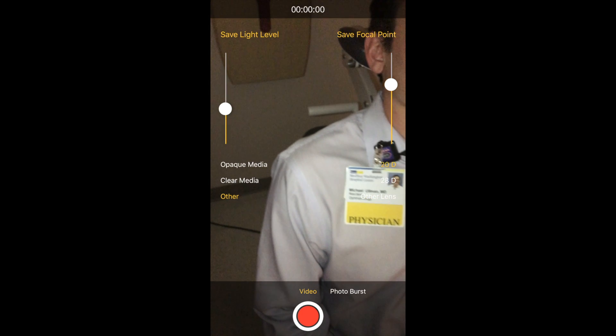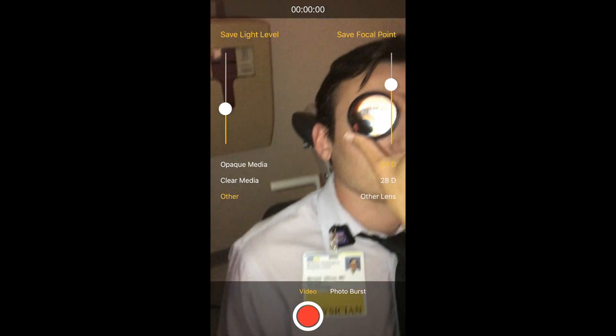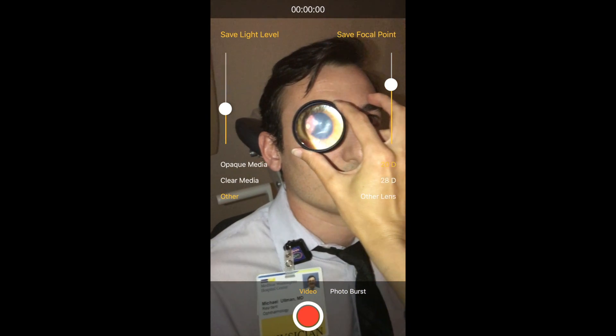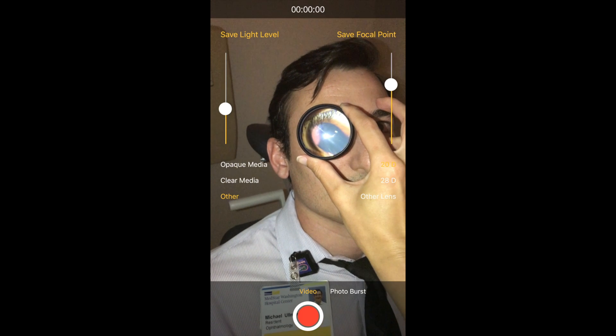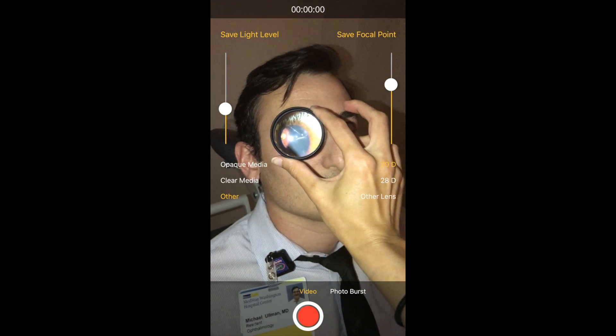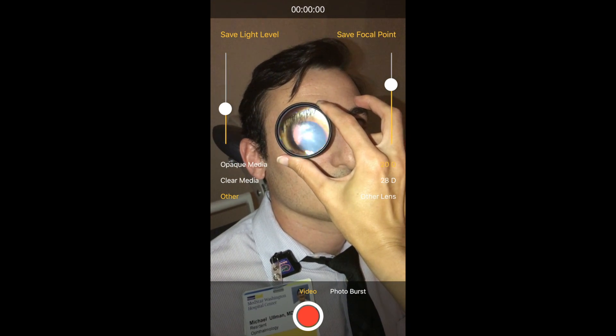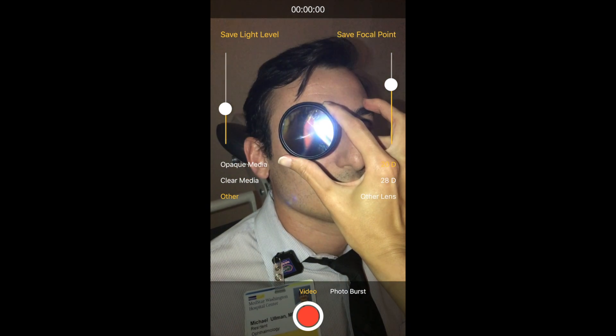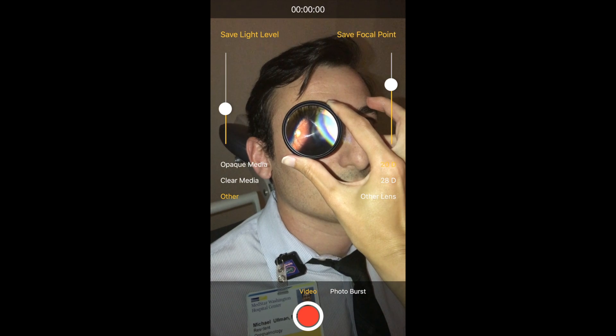As you can see at the bottom, it's now switched to video mode. You want to do the same thing: get your light level ready and get your focal point in the correct spot.